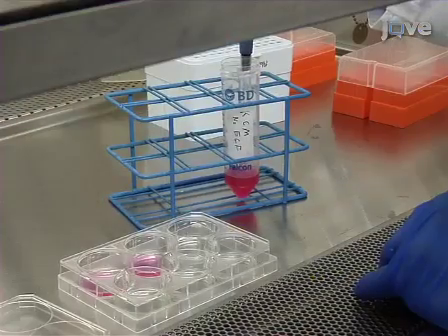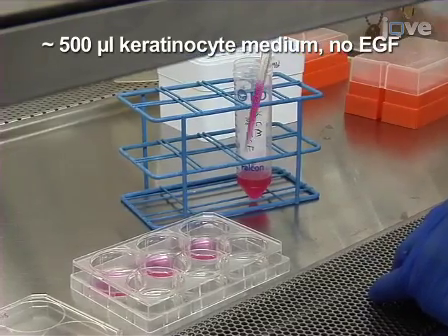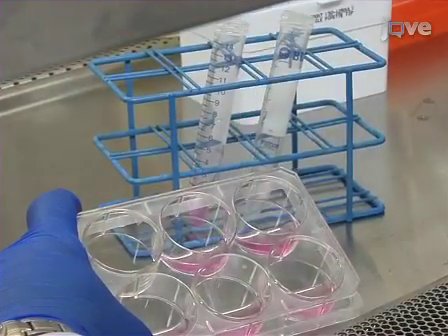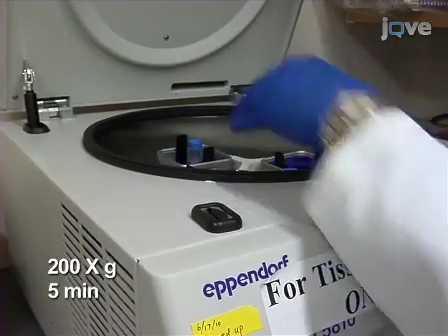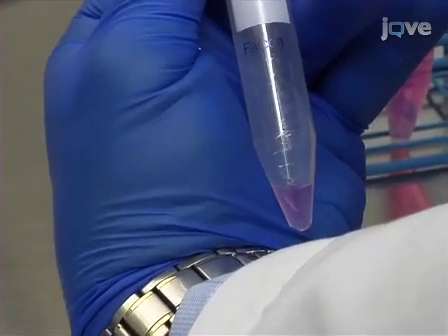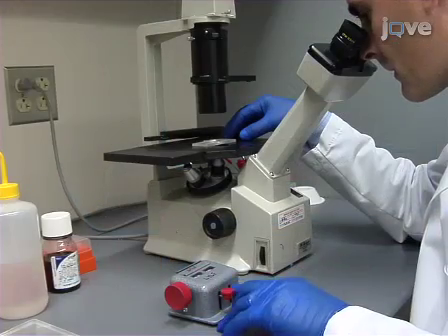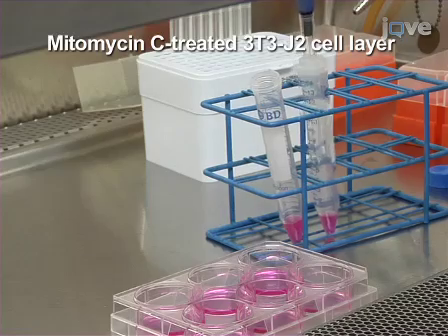Incubate at 37 degrees Celsius for 7 to 15 minutes to allow the hair follicle stem cells to fully detach. After the cells have detached, add approximately 500 microliters of keratinocyte medium without EGF to stop the trypsin, and gently pipette up and down to disperse the cells. Collect the cells in a conical tube and centrifuge at 200g for 5 minutes. Aspirate the supernatant and resuspend the cells in keratinocyte medium without EGF. Finally, count and replate the cells onto a mitomycin C-treated 3T3-J2 cell layer.